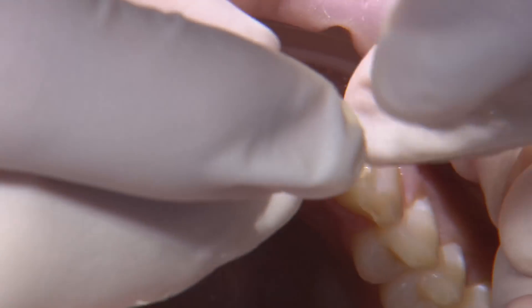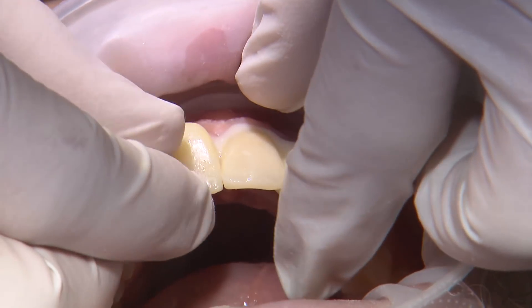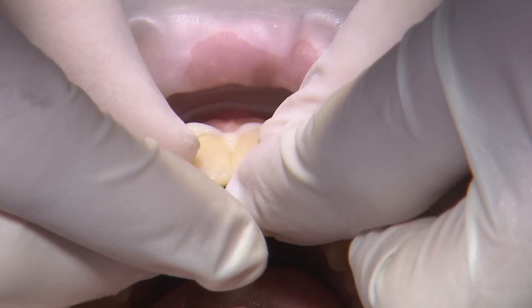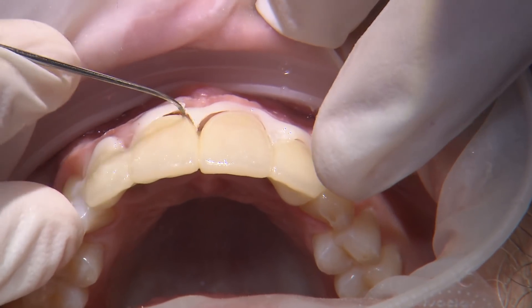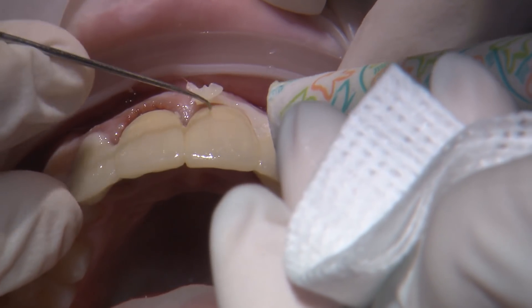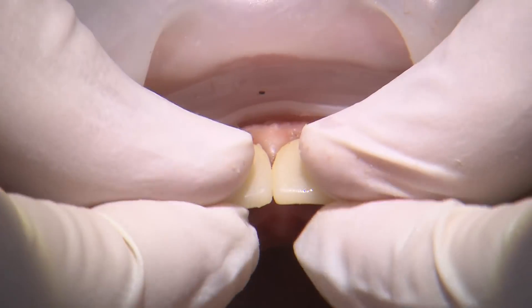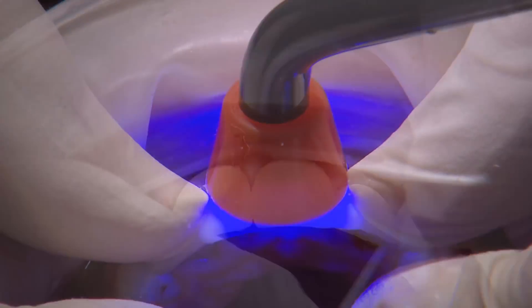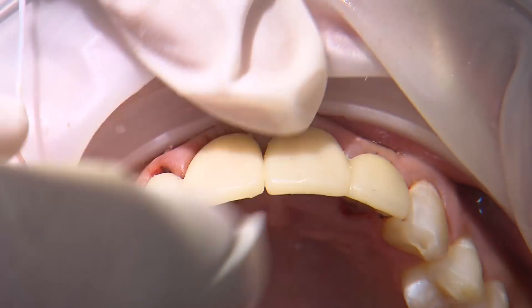I apply a thin layer of Vaseline to the preps to aid with removal after they're cured. One of the most challenging situations when provisionalizing veneers is keeping them in place while the finals are being fabricated. There's no temporary cement that can keep these in place and we don't have any mechanical retention to rely on. So I found the only way to hold these on is to bond them at the center of the labial surface. I spot etch with phosphoric acid in about a 2 by 2 millimeter area on the labial surface of each prep, then cure a bonding agent directly where I etched, and place a small amount of camouflage flowable composite on each area before seating the provisionals.